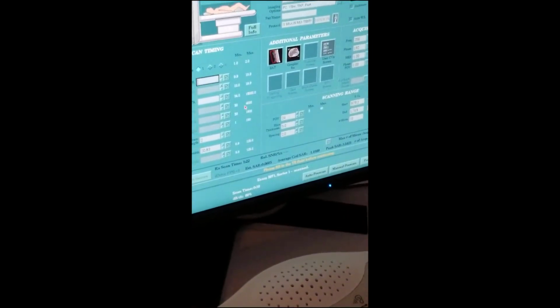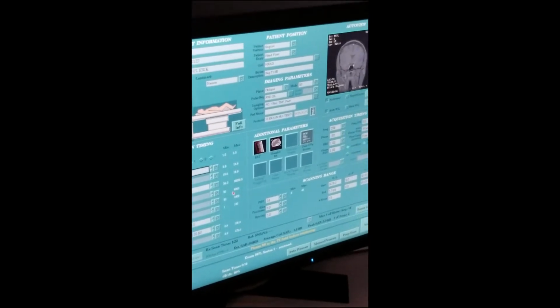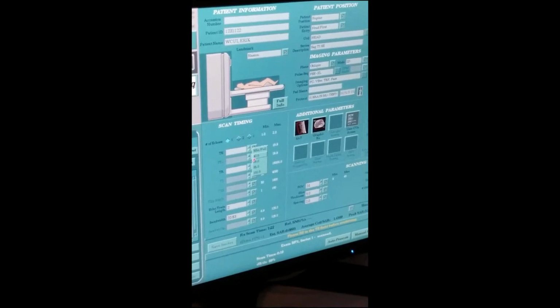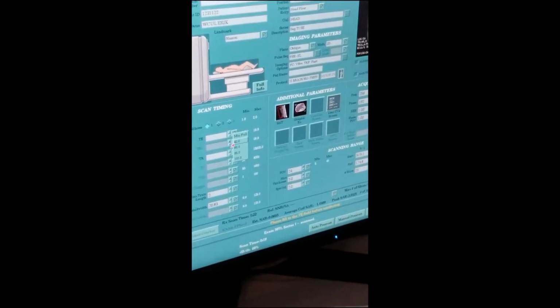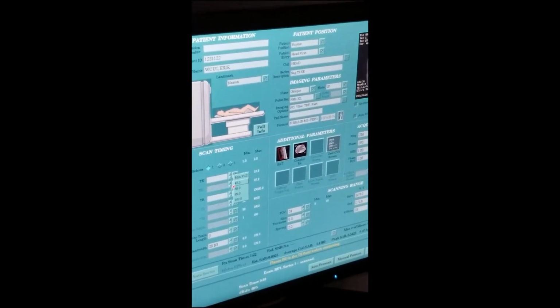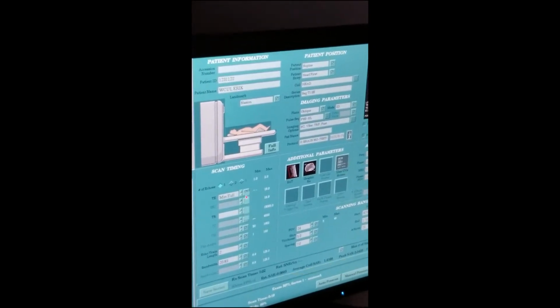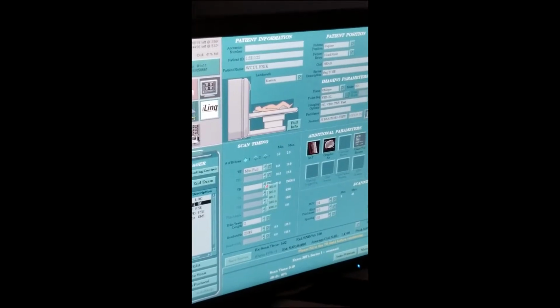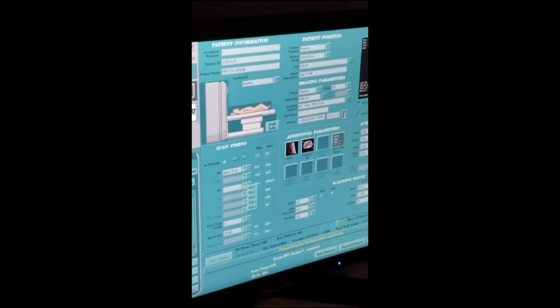But those options are not always available or not always correct. So you click on it and hold it. I said short, under 40, or I said minimum full. Remember? Minimum full. You can use minimum full, so it automatically fills it up for you and decides what TE is gonna be. The machine does it for you.